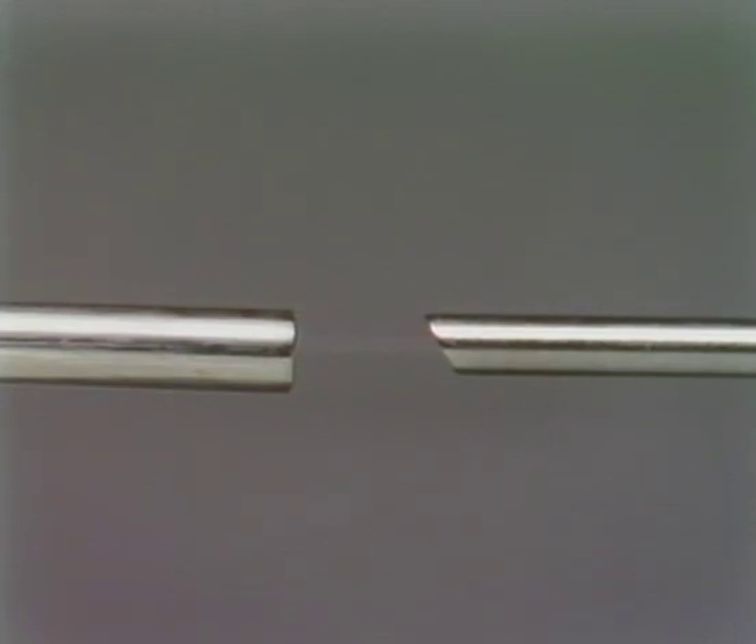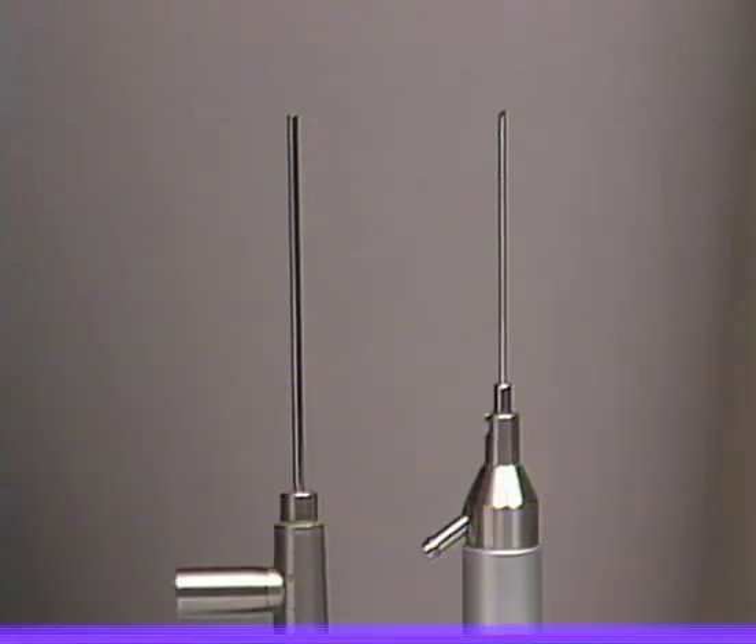Arthroscopes can also possess different angles of view. The arthroscope on the left has a zero-degree angle, while the scope on the right has a 15-degree deflection from the horizontal. 30-degree and 90-degree arthroscopes are currently available, and their selection often depends on individual operator preference and the approach adopted to the joint, whether it is lateral, inferolateral, or endaural.